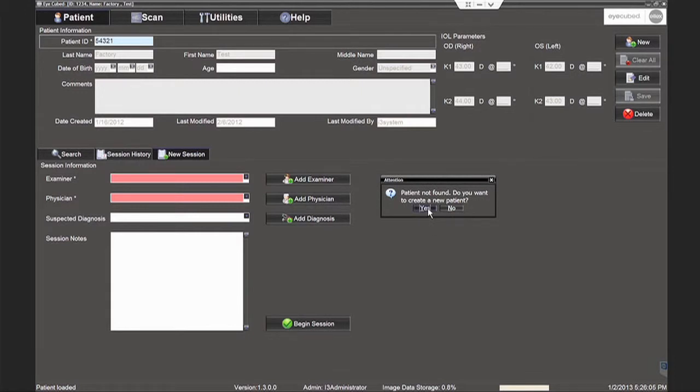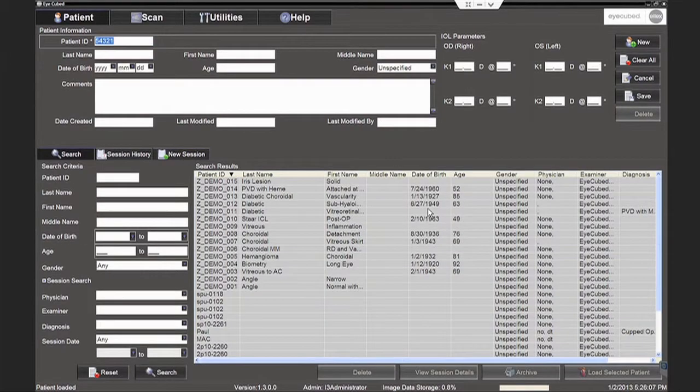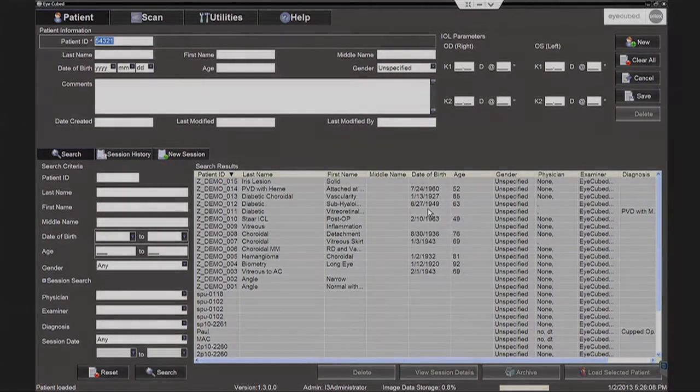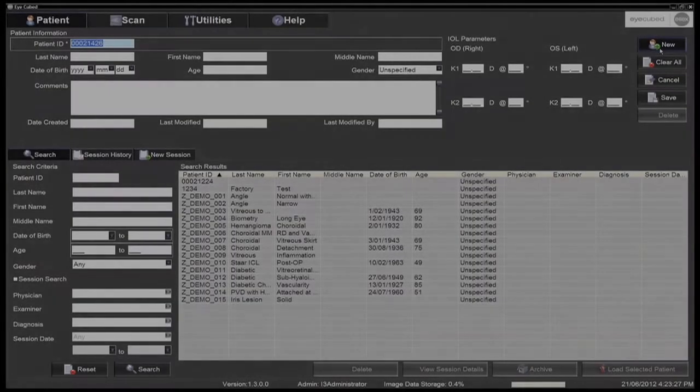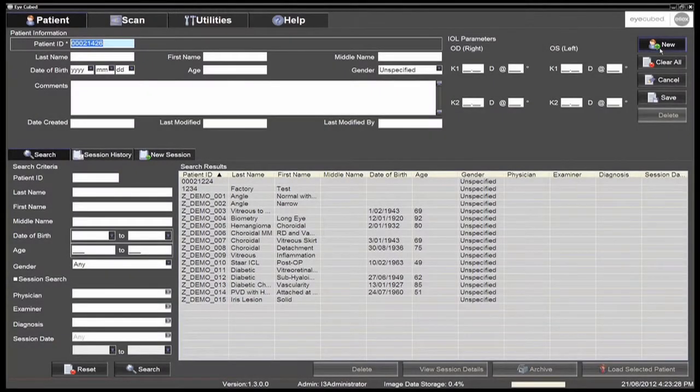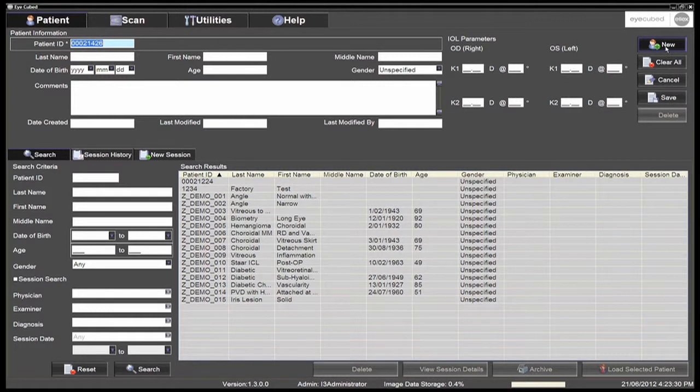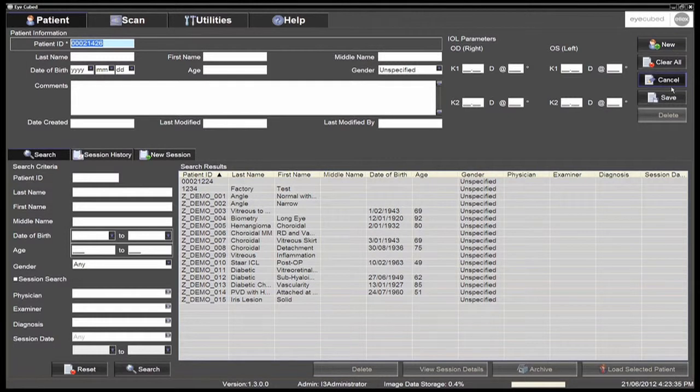Entering a new patient ID prompts the user to answer yes to creating a new patient. As an alternative, the system can automatically generate a new patient ID. See option in the general tab under utilities. The new patient data can then be entered, followed by clicking save.